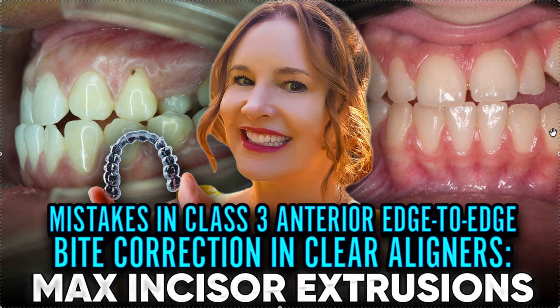Sometimes you guys aren't taking your Cephs and your CBCTs. You're looking at this magical case that this bot AI robot thing for treatment planning did, and you're like, that looks nice. It looks magical. Yeah, it was magical. It's not working. So sorry to tell you.